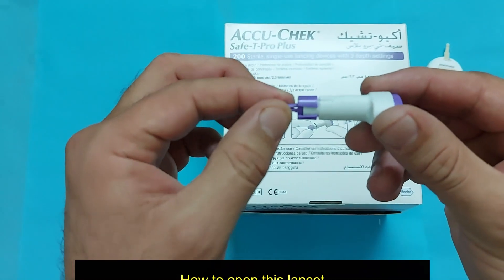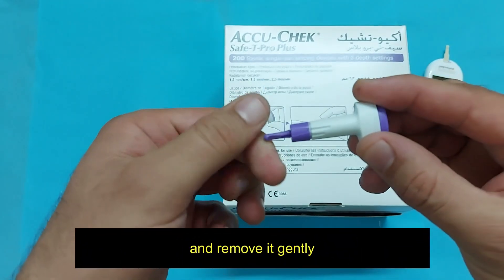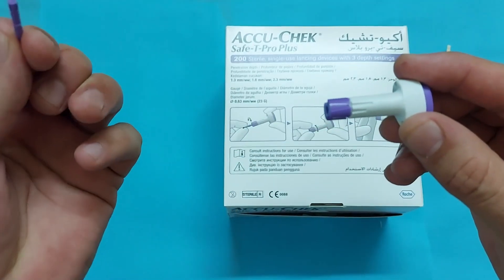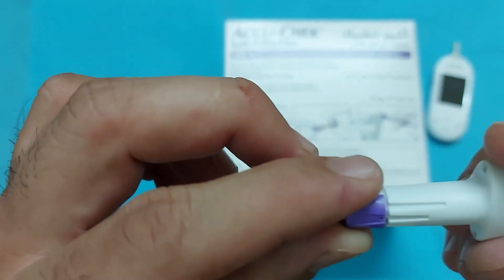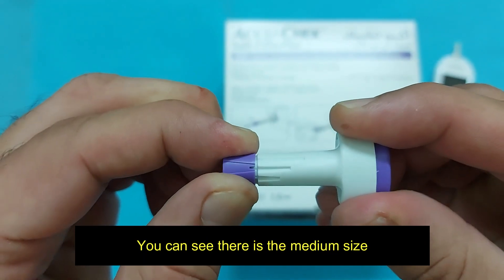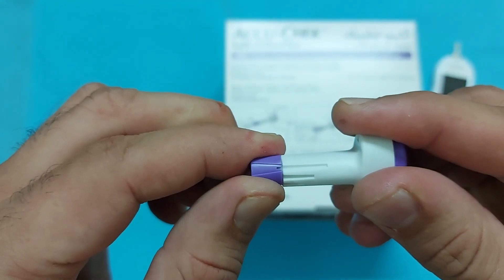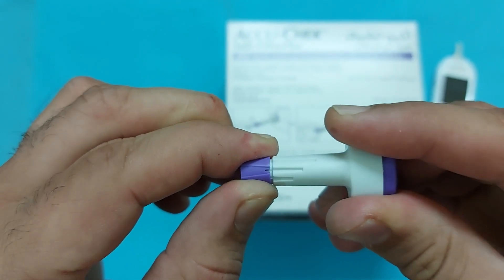Just rotate this part anti-clockwise and remove it gently. Now in this part you have to adjust the needle size. You can see there is the medium size, the bigger size, and the smallest size.